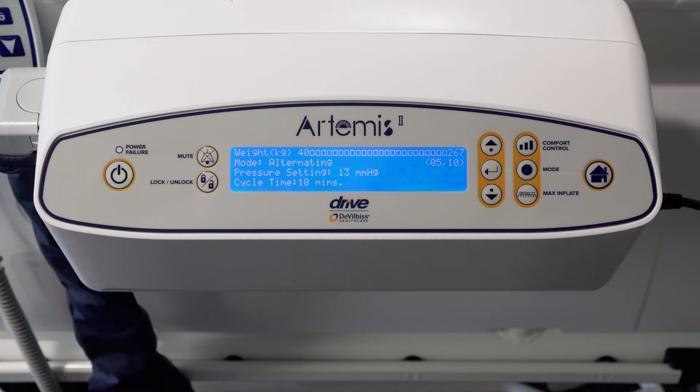The mattress automatically defaults to alternating mode when it is switched on. The three main modes are alternating therapy mode, constant low pressure therapy mode, and pulsation mode. The therapy selected will appear on the home screen on the front of the pump. Patients can be prescribed both alternating or constant low pressure depending on their needs and the clinical judgement of the carer. Constant low pressure allows the mattress to contour to the patient's body, reducing contact pressure by increasing the surface area over which the patient is supported.